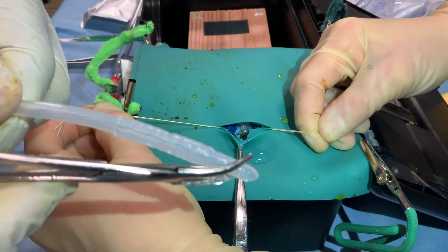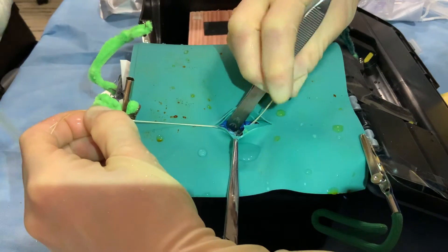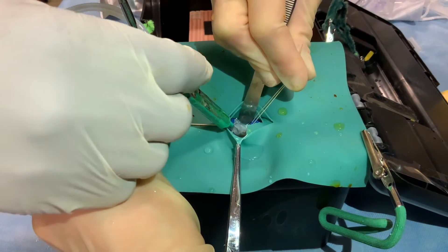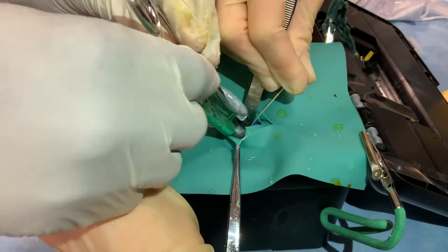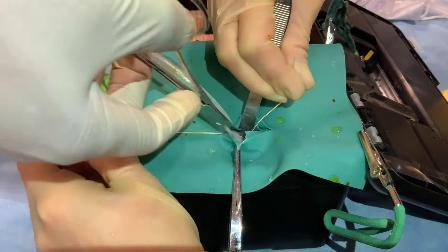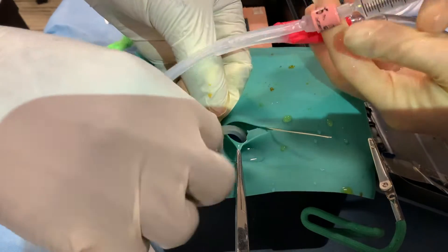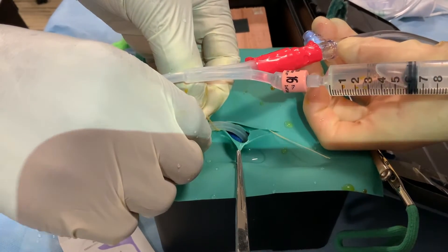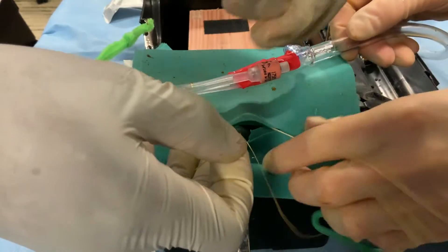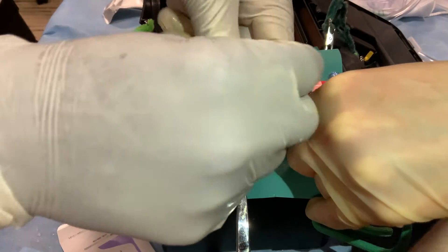The tip of the Foley catheter is loaded onto a hemostat or other curved clamp. The assistant then retracts as the surgeon makes a small vertical stab in the bladder wall with the scalpel. They then slide the Foley through the incision and into the bladder with the curve of the clamp facing superiorly, unclamp, and guide the Foley further inside the bladder. Once the balloon is securely inside the bladder, the assistant can inflate the balloon of the Foley with a 5-milliliter syringe. The surgeon then ties the stay sutures around the Foley, keeping appropriate tension to secure the tube while not kinking the lumen of the Foley.